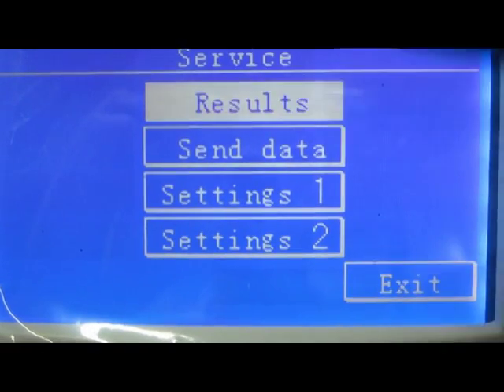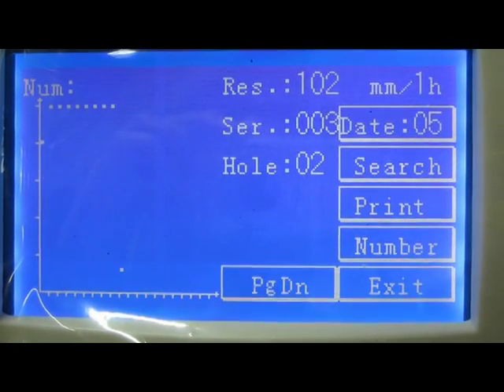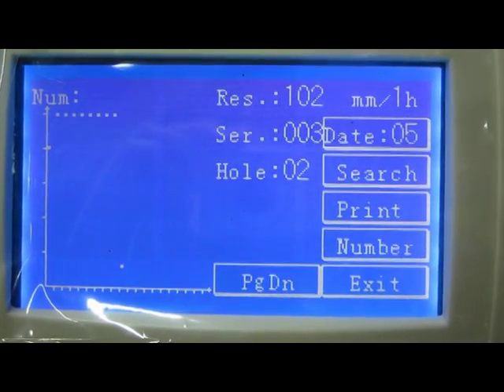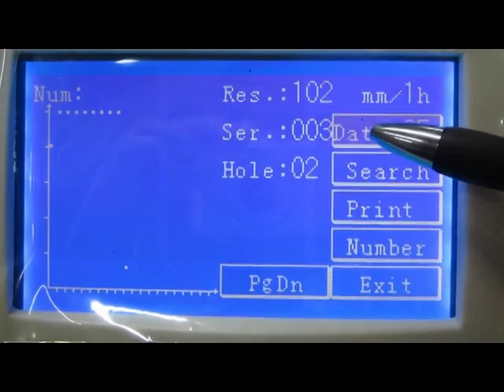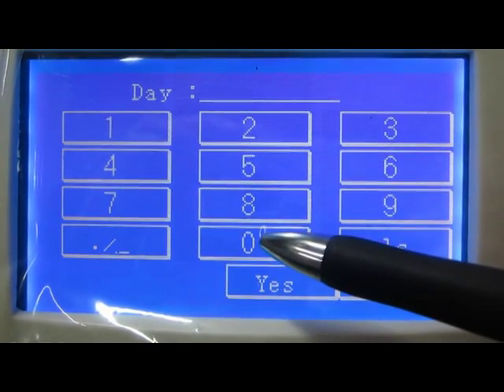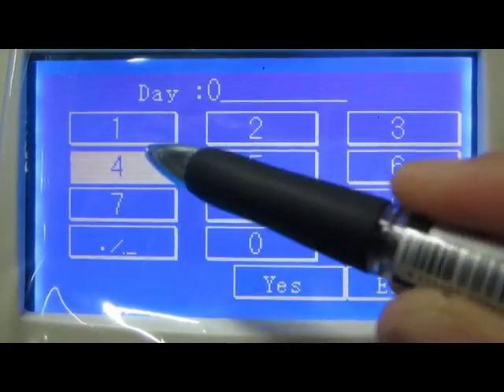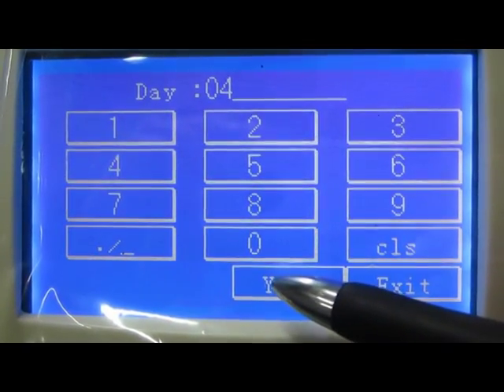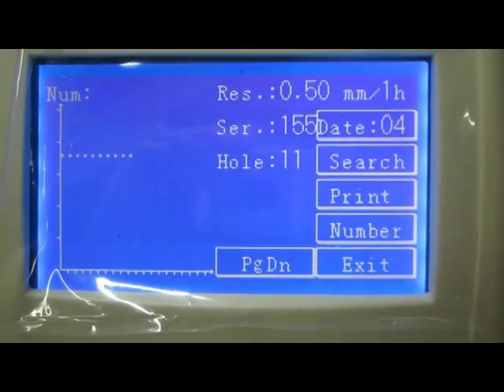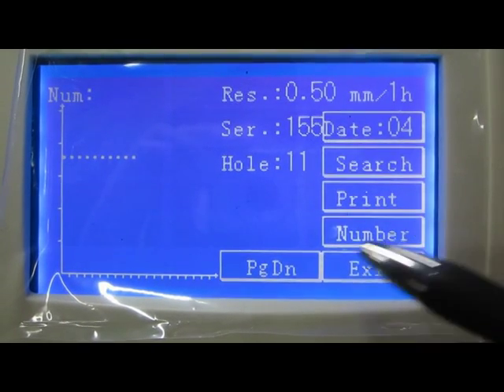There are 100 results saved within one month. The user can click page down to check the result of that day.